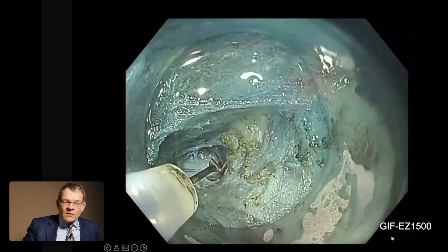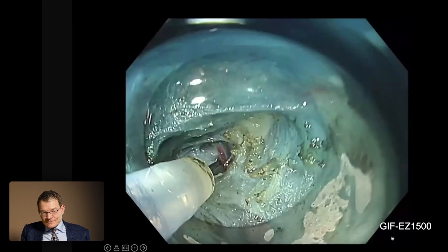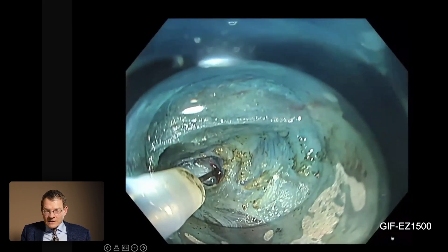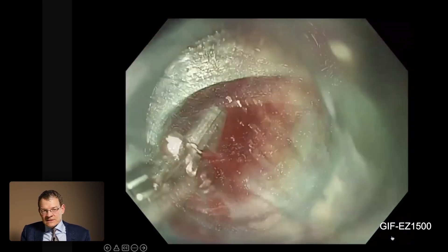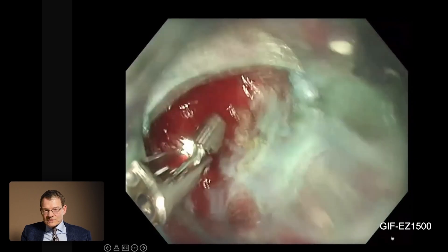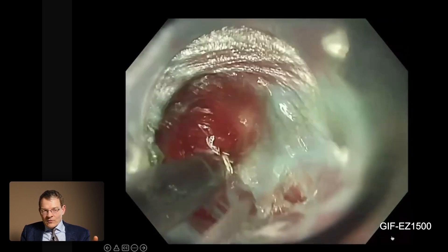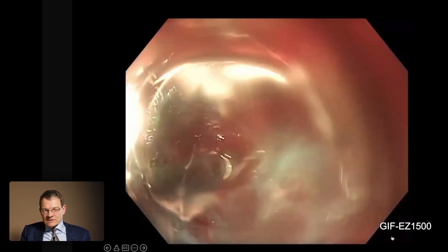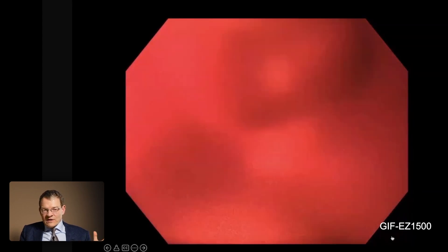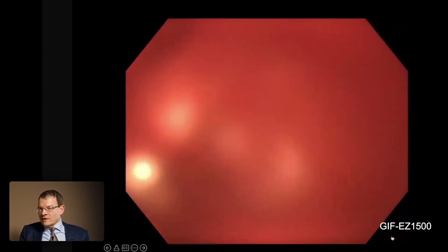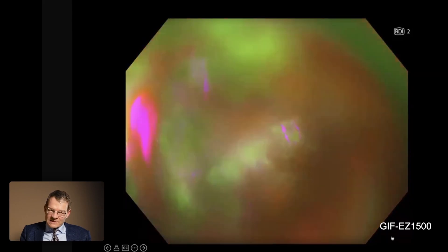This is now a very critical situation in a POEM procedure. In the area of the cardia, incidentally a vessel was cut, and here you may appreciate that the first attempt to stop the bleeding with regular white light made the situation even worse. All of a sudden everything turns red — you are in the tunnel and the situation is a little bit uncomfortable.